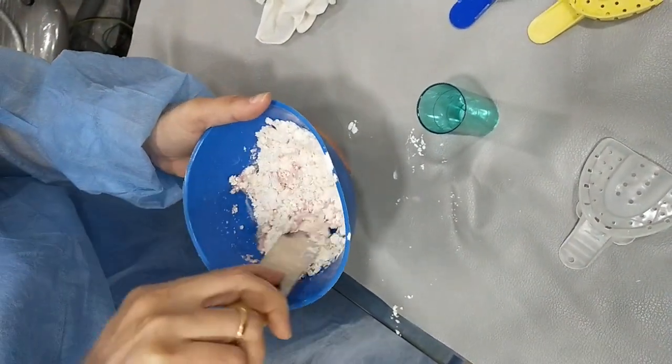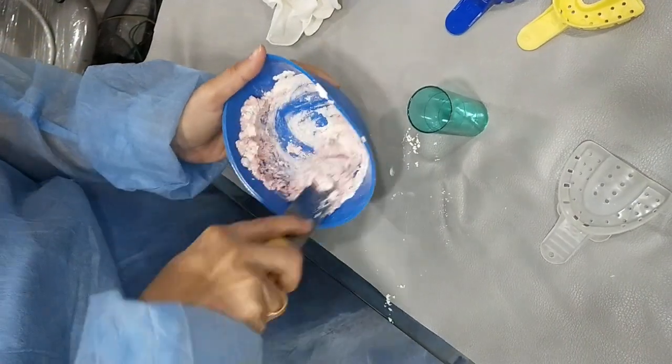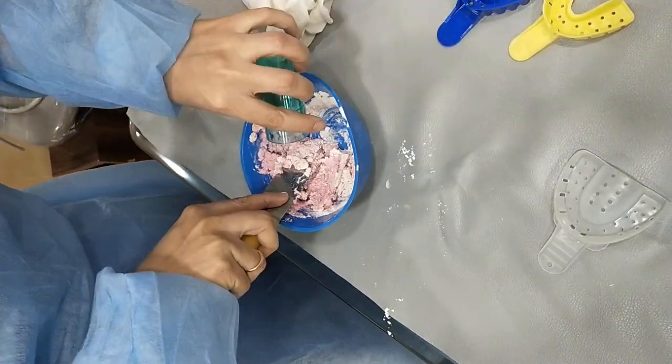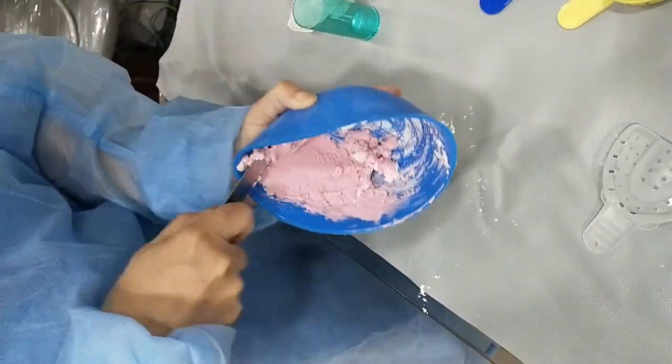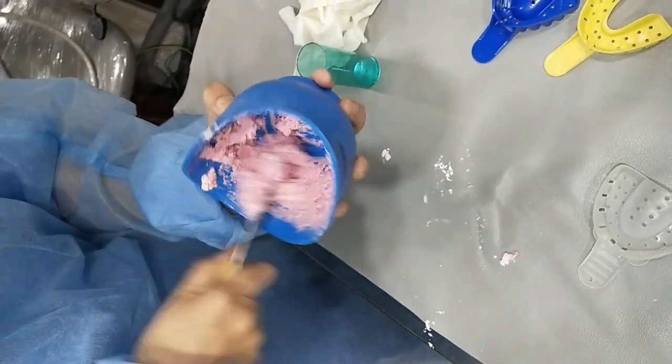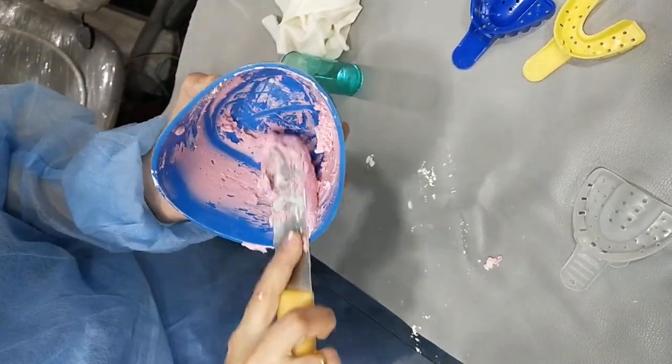So, with this, we commence the mixing of the material. Also, start pressing the material against the walls of the bowl to avoid any air bubbles.